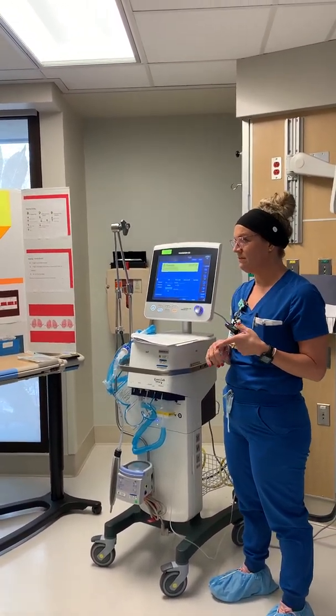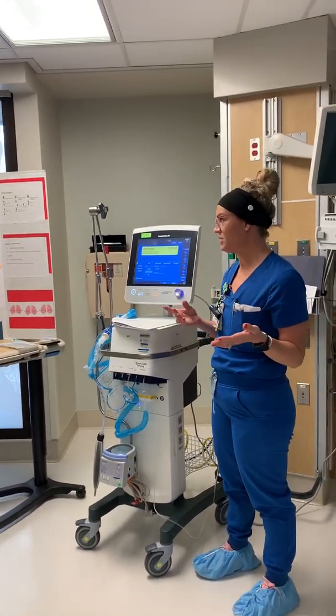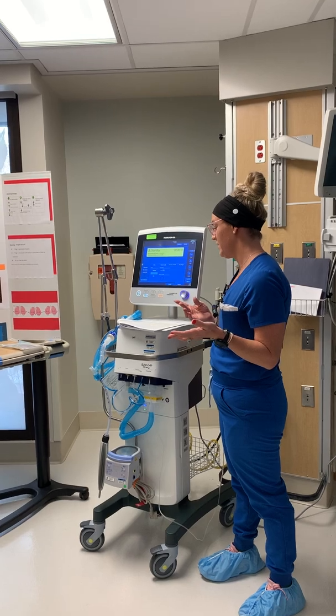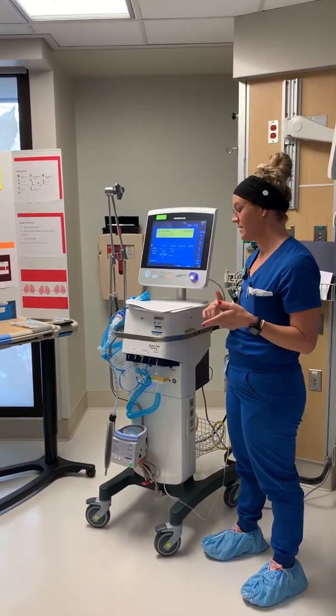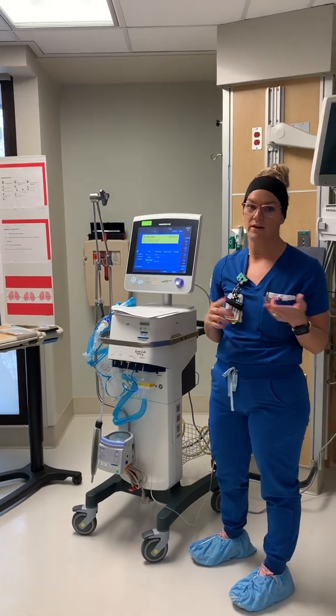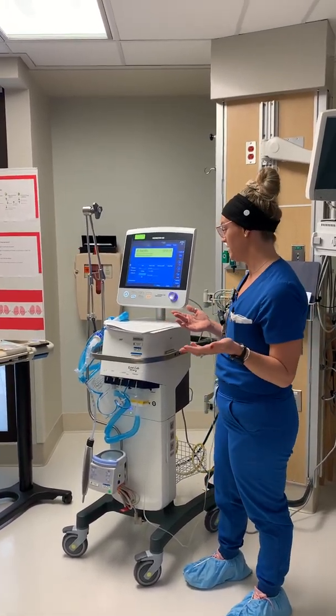Proning is what you want to do first, but if for whatever reason the patient cannot prone — they're too obese or there's some contraindication — APRV is a good alternative. The ARDS patient is the one we see the most, particularly patients with ARDS who are not responding to lung protective strategy modes of ventilation.